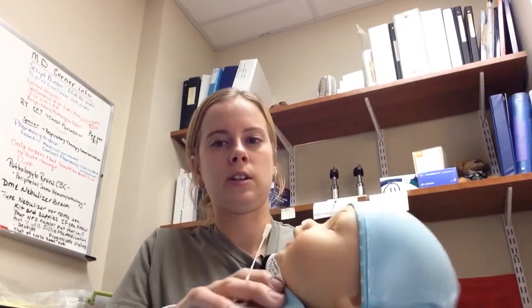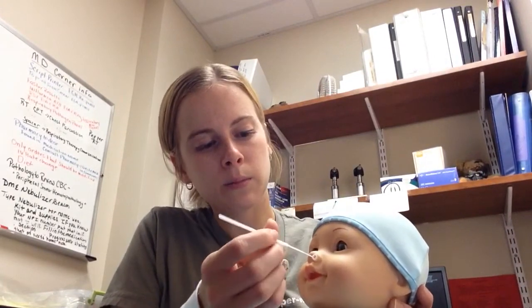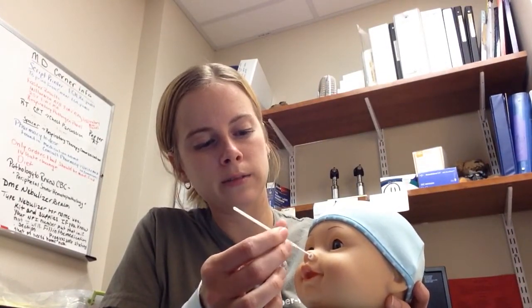And so with the nasal swab here, I actually have one here. You just want to make sure that you place it in until you hit some resistance. You want to swirl it around 2 or 3 times, and you want to hold it for at least 5 seconds. So if this is our kiddo here, put that in, swirl it around, 5 seconds, pull it out. Alright. And then for oxygen needs with our respiratory kids, a lot of the O2 sats to be above a certain range is really depending on the doctor's order.